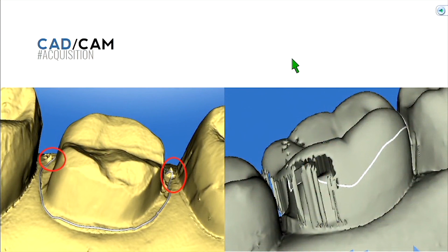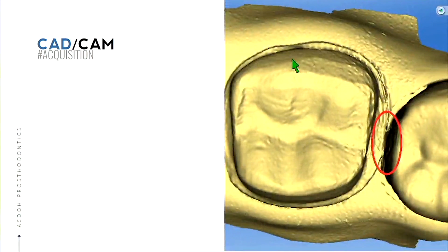All right, so just other images of bad data. It's important to keep, for our purposes, our margins supragingival so we can mark them clearly. Obviously, clinically, you're going to work with your clinical faculty to determine the most appropriate margin placement. But just know if you're equigingival or subgingival, it's going to require a little bit more work because you still need to get tissue retraction, right? So those principles still apply.